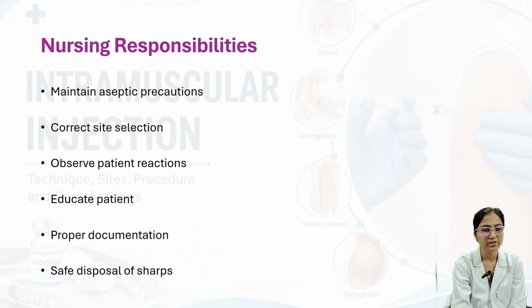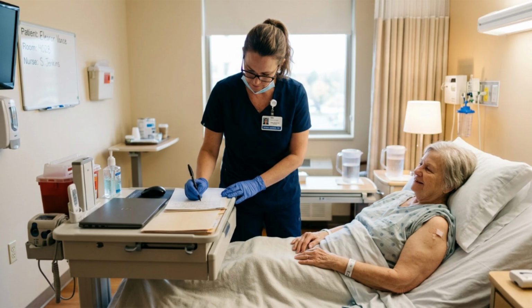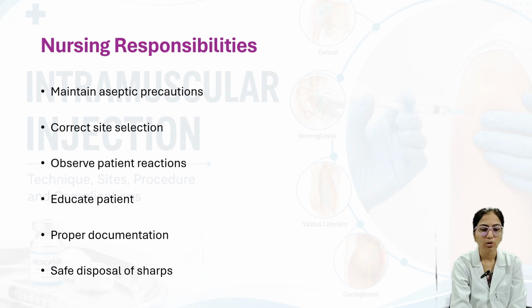Next, we'll see nursing responsibilities. Here, the nurse has to maintain aseptic precautions, correct site selection, and then observe patient reactions. Also, we need to educate the patient, and then proper documentation. Documentation is very, very important. And then safe disposal of sharps.